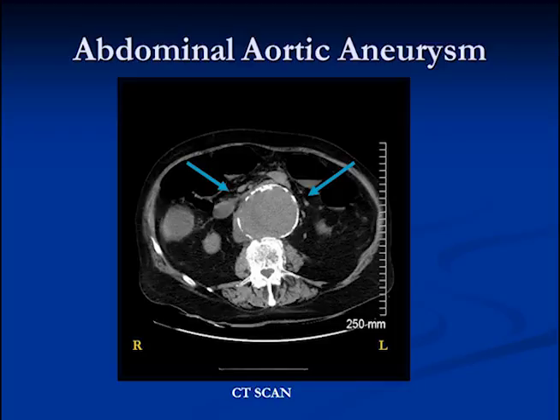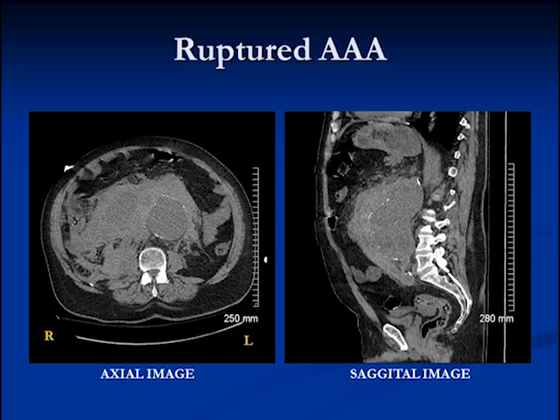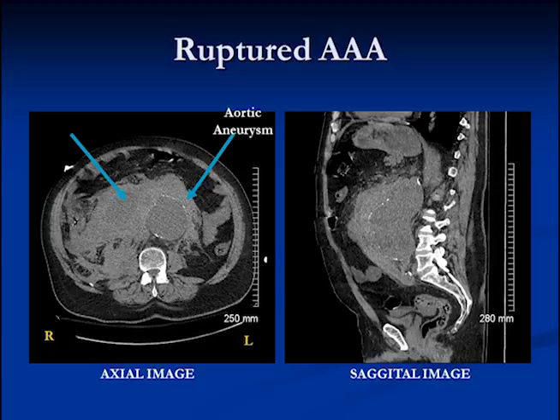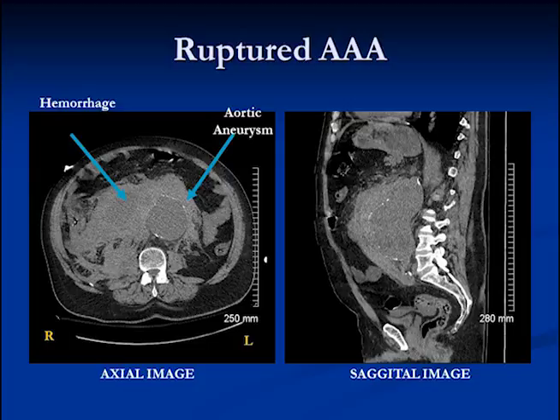These patients have to be watched because frequently these will rupture. This is an example of a ruptured abdominal aortic aneurysm. Again you can see the calcification around the wall of the aorta, and you can see the area of hemorrhage, which appears whiter compared to other areas — any blood on CT looks whiter than adjacent soft tissue. You can see obliteration of the fat around the psoas margin on the right side. On the sagittal reconstructed image, you can see centrally where the aorta is with the calcification, and around it is the area of hemorrhage.